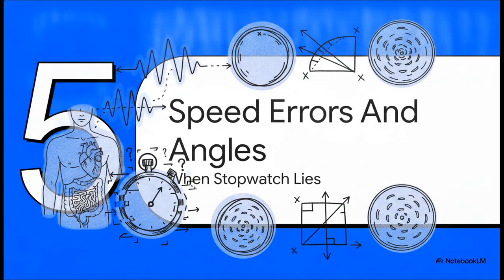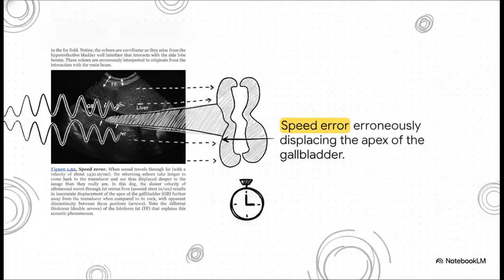Let's move to Section 5, Speed Errors and Angles. This is what happens when the stopwatch lies. This brings us to the human element and the machine's ultimate blind spot. Earlier, we noted that the machine assumes sound always travels at a constant 1540 meters per second. Well, here is exactly where that assumption falls completely apart.